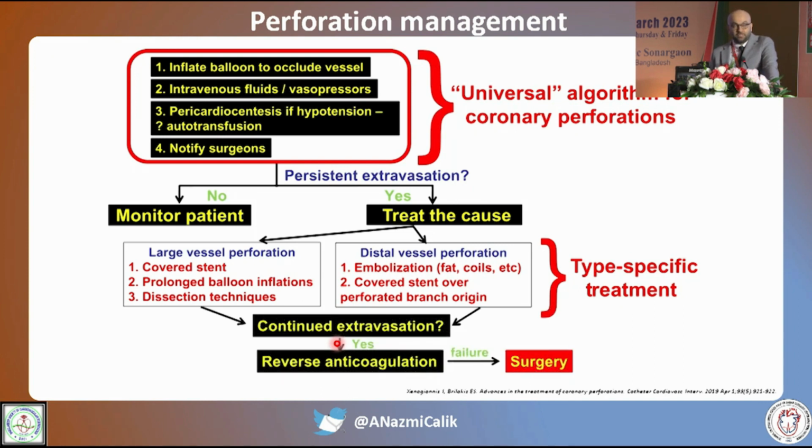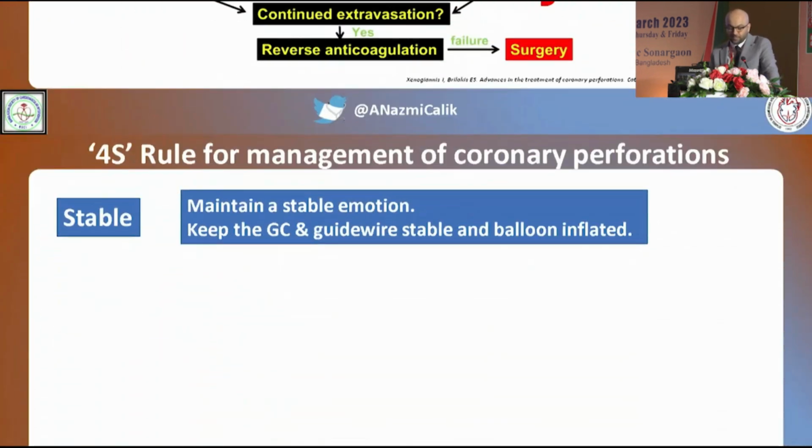If you still have continued extravasation, you can reverse anticoagulation at this time, after you remove all the gear you have in the coronary territory. And if you still can't sort out the problem, please do not hesitate to call the surgeons.